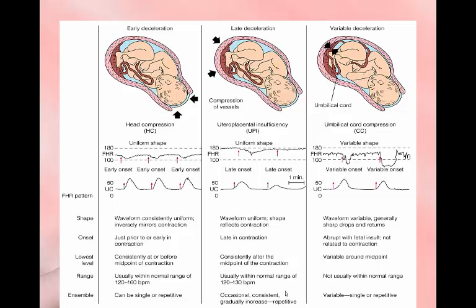Okay, so if the oxytocin is infusing, turn it off. Get that patient's position changed, IV fluid, O2. Okay, and we're going to assess this contraction pattern. If you do those things and we've had a few more contractions and this pattern persists, we need to notify the healthcare provider because this patient is probably going to need an urgent cesarean section for delivery.